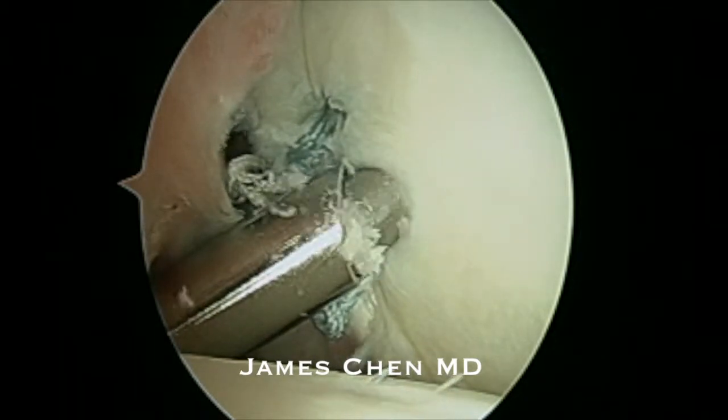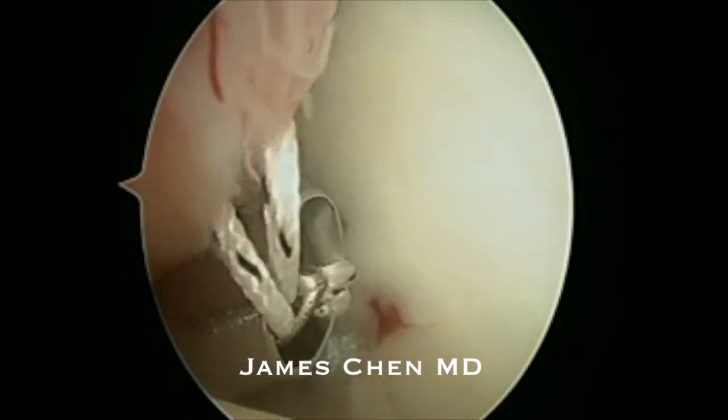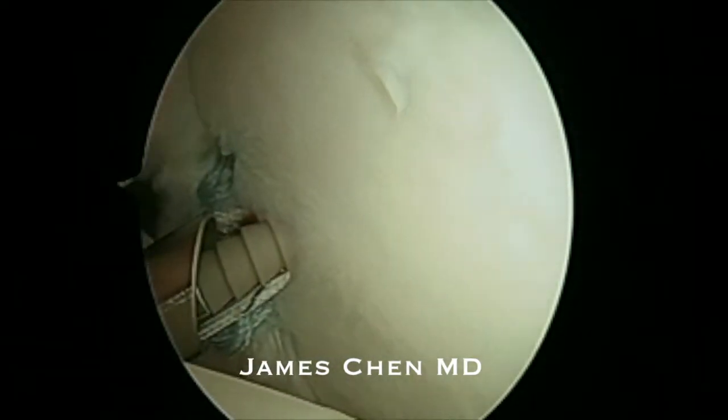Once again I drill through the percutaneous accessory portal, pass sutures into that portal, load up the 2.9 push lock, and then impact this into the glenoid.